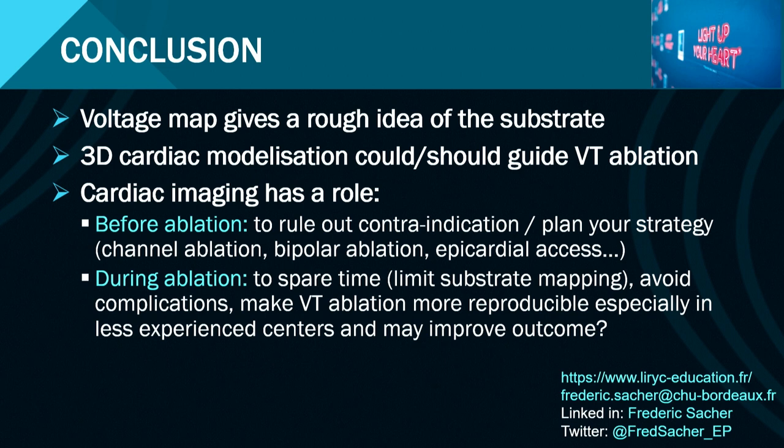It rules out contraindications of thrombus, not only in the LV, but also in the left atrial appendage. In a series we just published in Europace, we also detected pulmonary embolism by CT scan before an intervention. It can help to identify the area of scar, whether you have to go in the septum or epicardial.